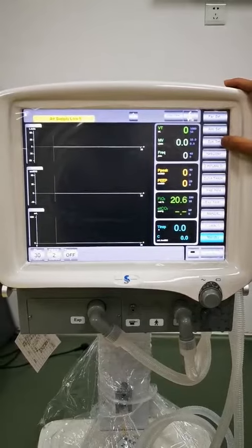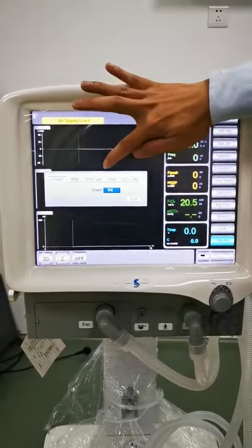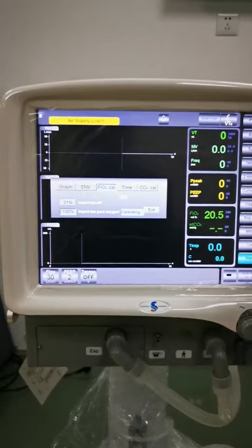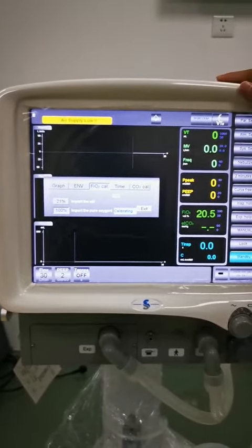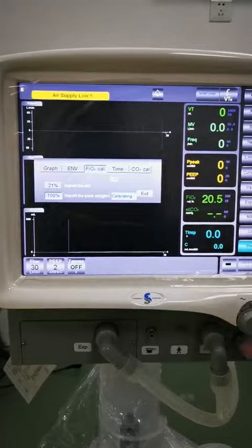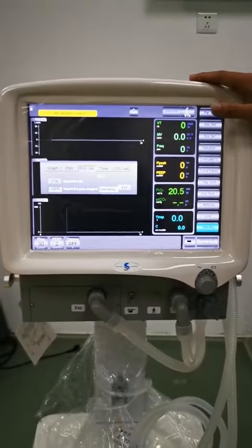Also press the third button on the right side and find the oxygen concentration calibration. Then we press the 100% button and it will perform the calibration automatically within two minutes. When the calibration is finished, we press the Exit button and the 100% oxygen concentration calibration is complete.